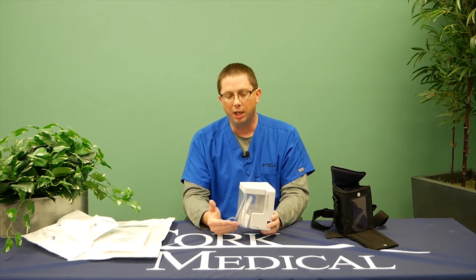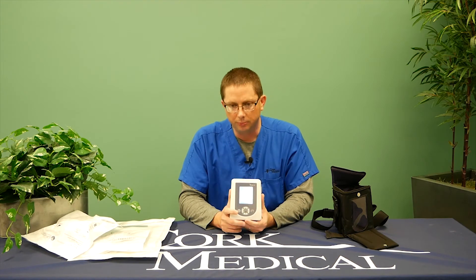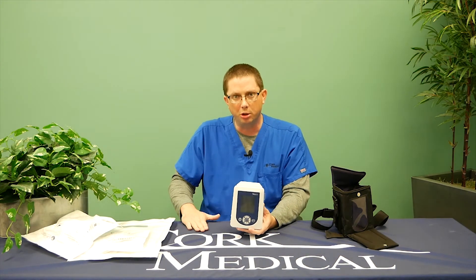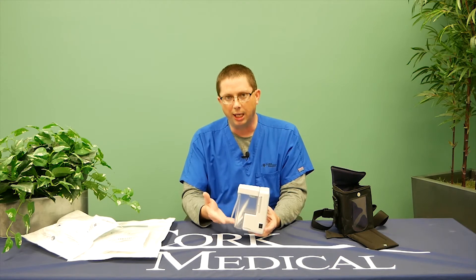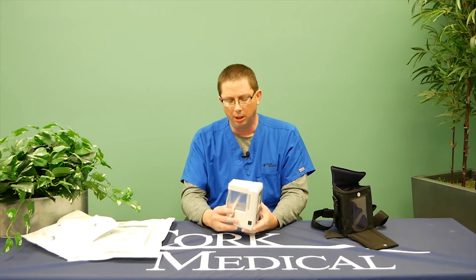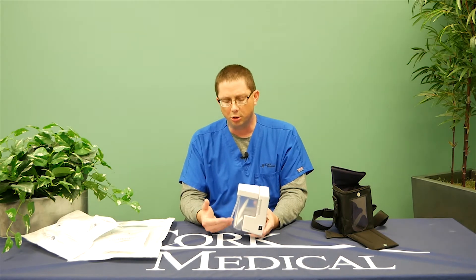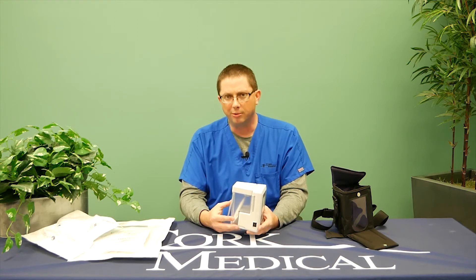If you notice your canister filling with frank red blood in a rapid manner, you need to immediately power off the pump. If you're able to reach your wound, apply pressure to the wound and call 911. It's normal to have a little Kool-Aid color or pinkish drainage, but the main cautionary note is if it fills the canister rapidly with bright red blood — power off the pump, hold pressure, and call 911. There is a risk of bleeding associated with negative pressure. Do not remove the dressing. If you notice any significant changes in your drainage, a smell, or the consistency of your drainage, you need to notify your medical provider of that change.